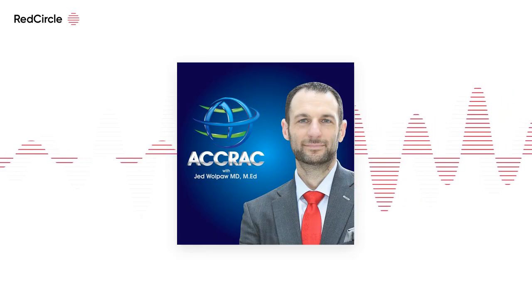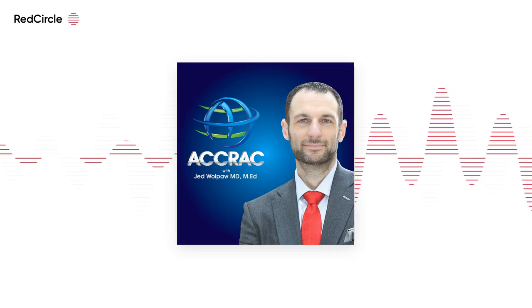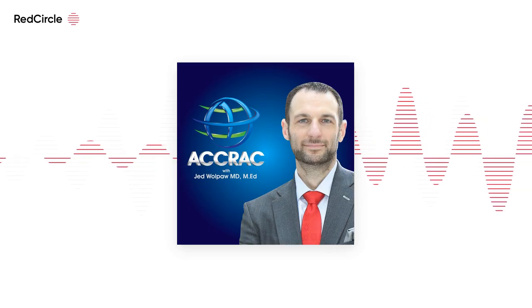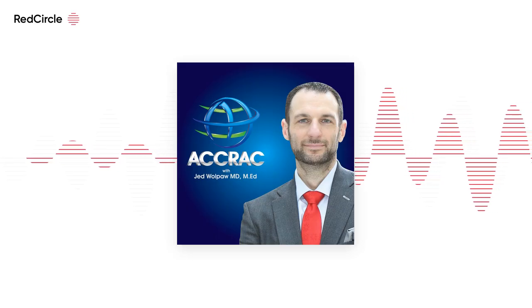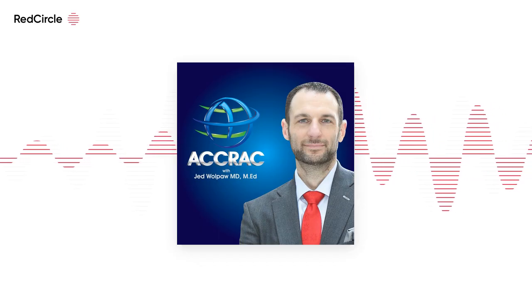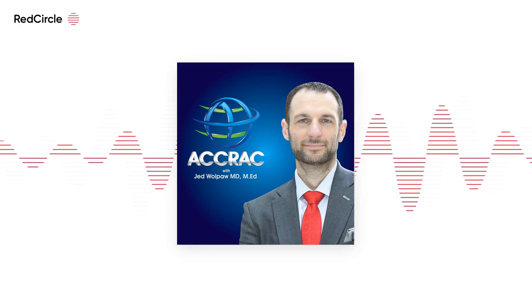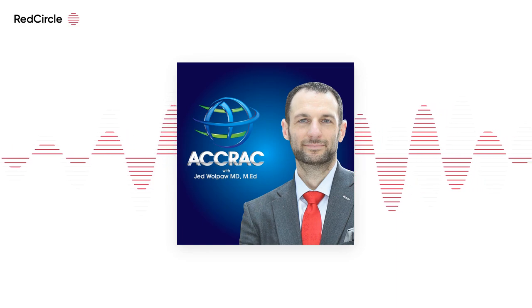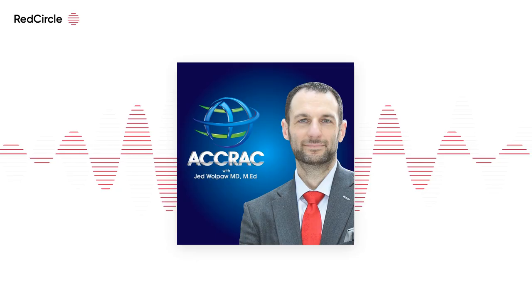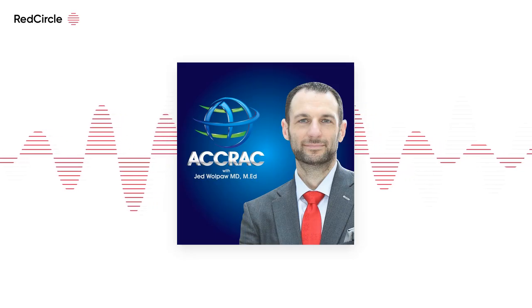So it sends this signal all the way around the chest once, and it gives you a tomographical slice. So you end up with an image of one time around the chest. But it goes around the chest 50 times per second. This is why it can capture ventilation in real time: as it's going 50 times around the chest in 1 second, it's showing you 50 images taken while the patient is inspiring. It's like a cartoon, right? It's 50 images being shown to you in succession, so it just looks like a video. And it's showing you the distribution of this impedance, which is just the tidal volume changes throughout the lungs.